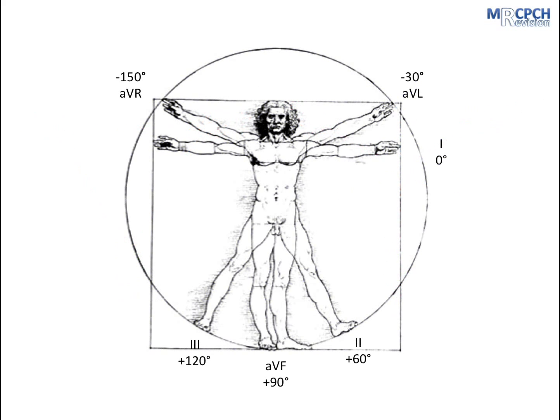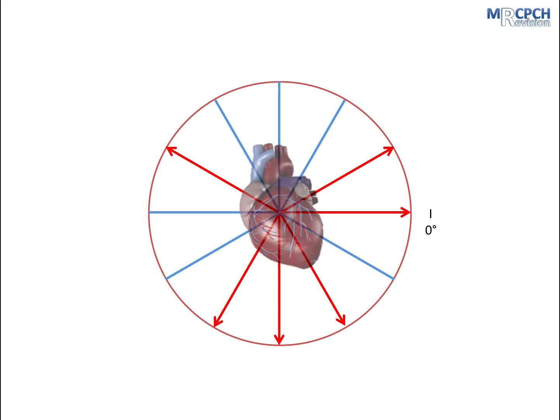Some people prefer to use Leonardo da Vinci's Vitruvian Man as a reference to remember it. Still other people have danced to YMCA to remember it. Whatever system works for you, works for you. So let's take a look at the system in a little bit more detail.